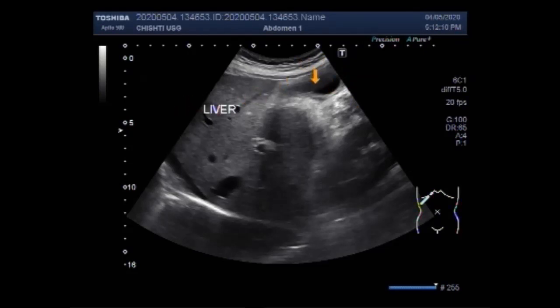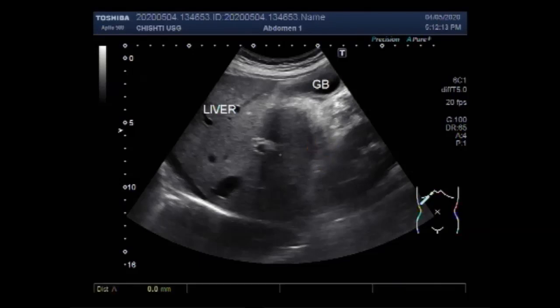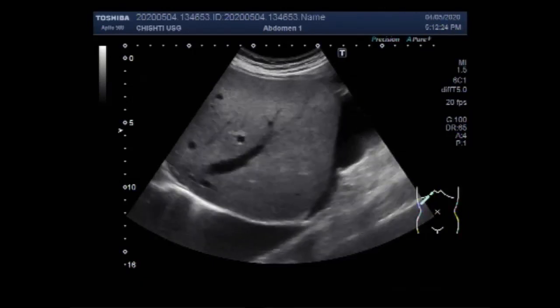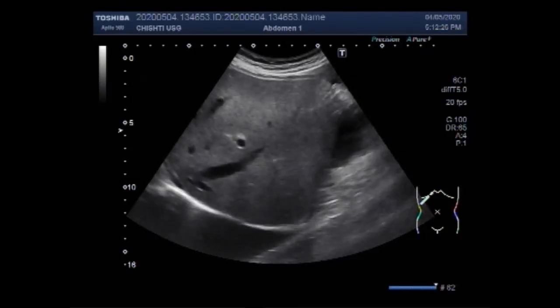You can see the liver. This is the gallbladder, and the gallbladder has a significant amount of echogenic sludge. The liver measures about 12.2 cm, which means that it is shrunken in size.